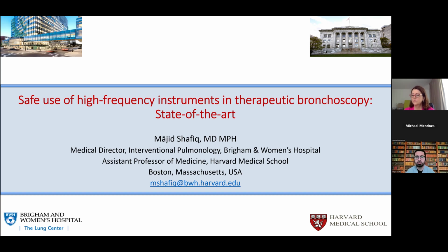Another thing that I sometimes do in those cases is still use the cautery snare, and I do it repeatedly. Sometimes, after like the fifth try, I'm able to actually get the whole stalk out. It doesn't always happen, but I've certainly tried that as well. And then I can use the cryo to yank out pieces. Yes, thank you very much.